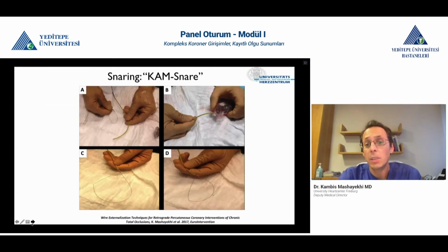Okay, sometimes I was invited to different places and you didn't have a snare, so I started to create a snare, where Sumitsuji also had the first idea, and I only copied it, but I modified it a little bit. He called it a homemade snare, and it was the same concept that I actually had, but on a normal catheter. So I modified it with a mother and child catheter.